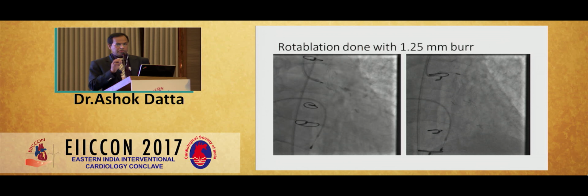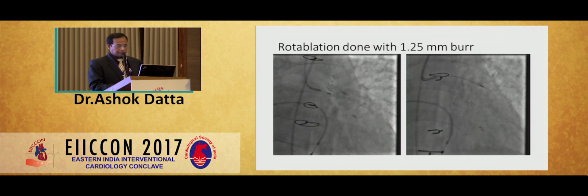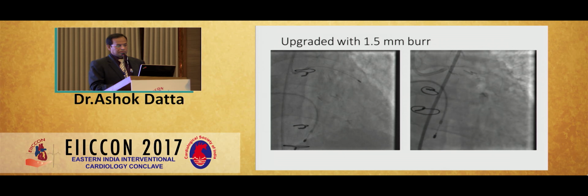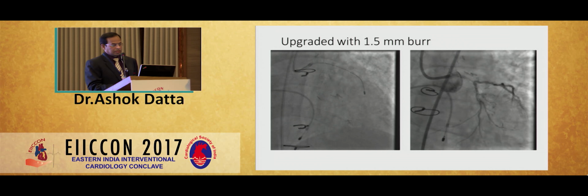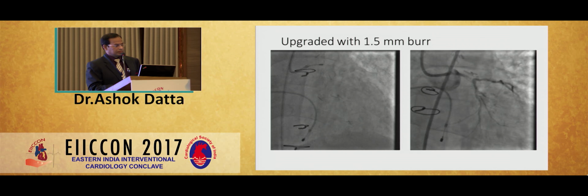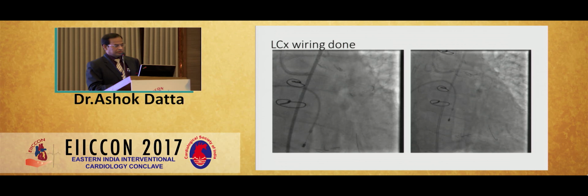So a 1.25 millimeter burr, several runs. Then the burr is upgraded to 1.5 millimeter. So this is the result after rotablation. So now LCX wiring done.